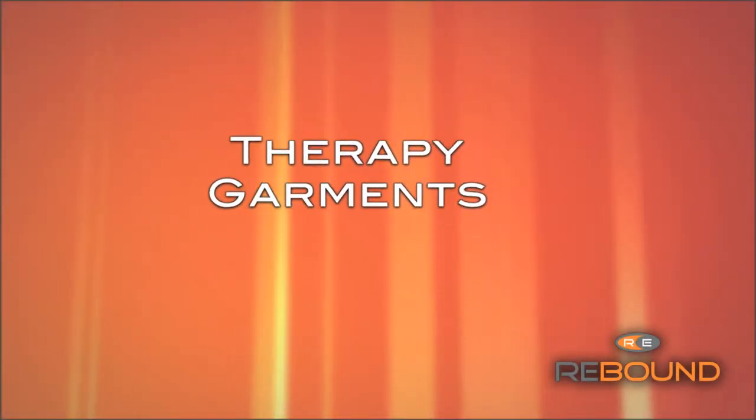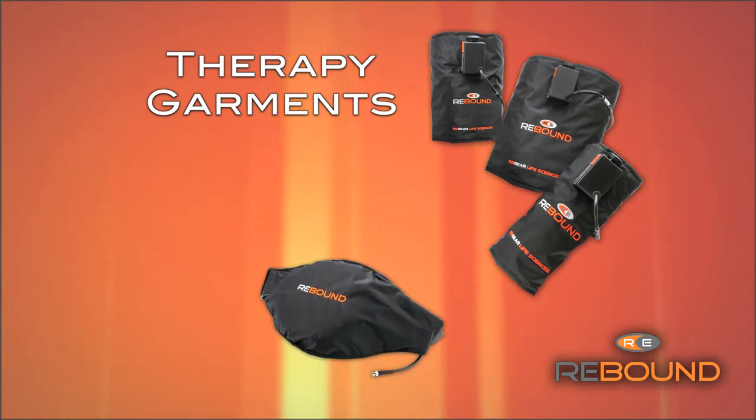There are three types of therapy garments to choose from: cylindrical, back, and shoulder.